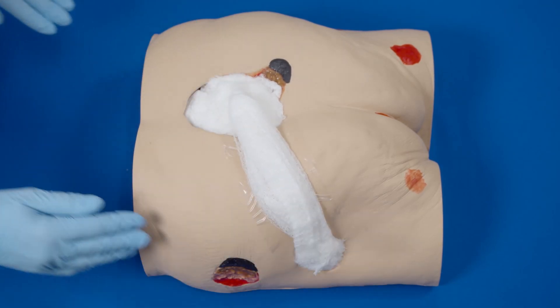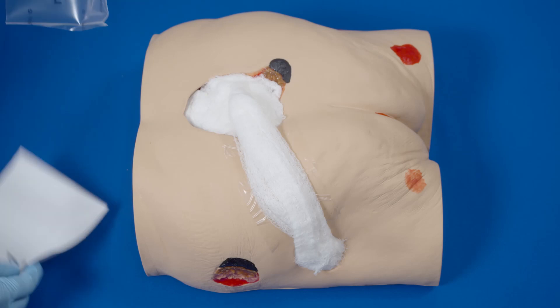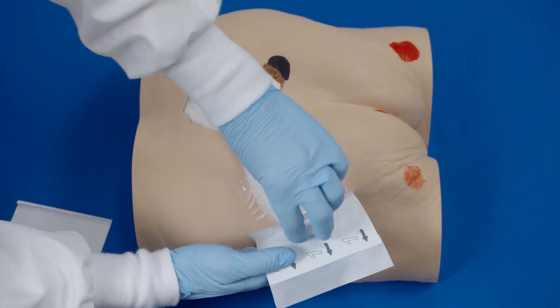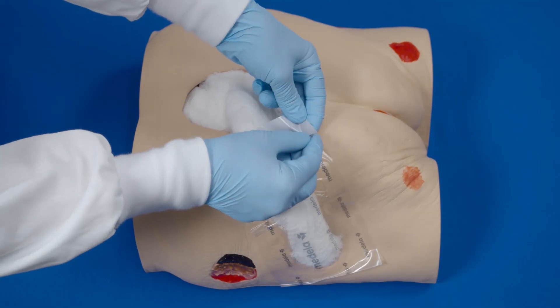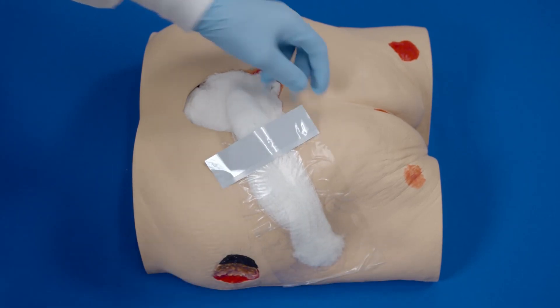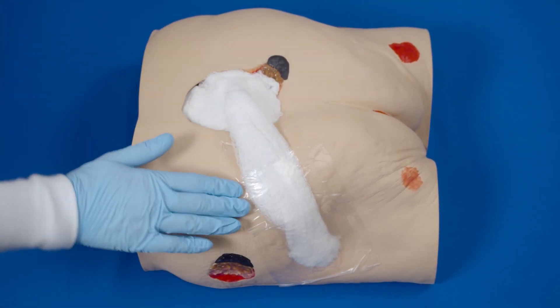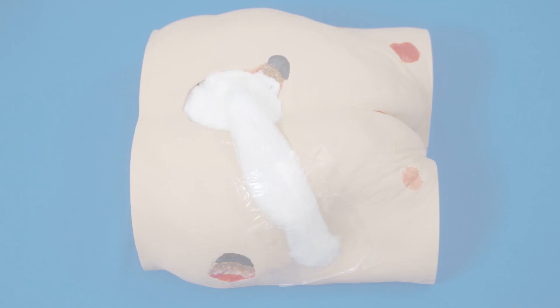Apply transparent film to cover all of the gauze — both wounds and the bridge. Partially peel back one side of layer one and place adhesive side down, then remove the remaining side of layer one. Remove the backing or layer two by removing the perforated silver-colored tab on the side. The film should extend three to five centimeters beyond the margin of the gauze dressing to facilitate an adequate seal.